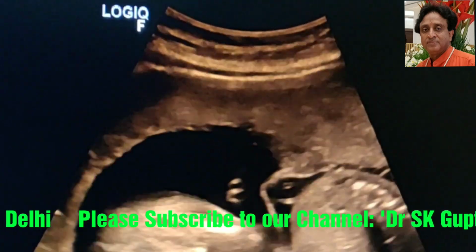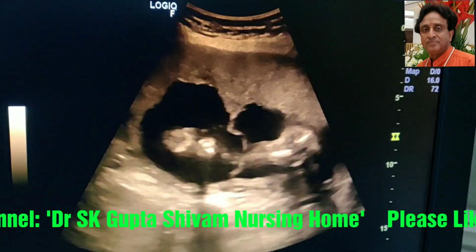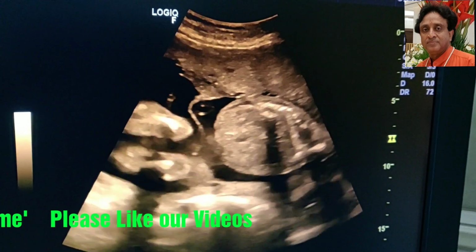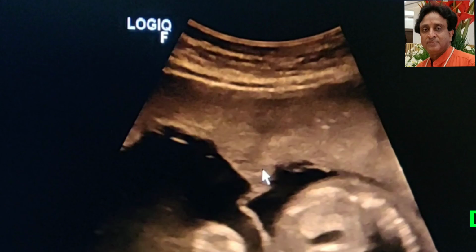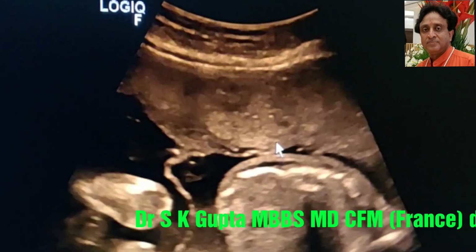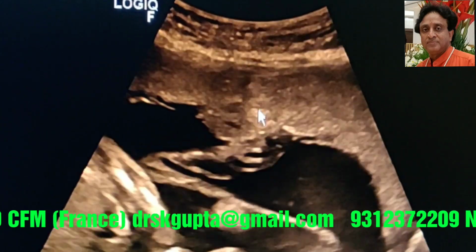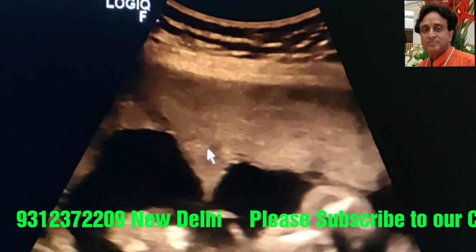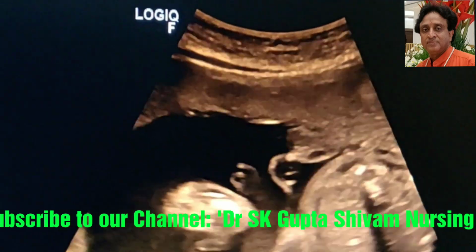Let us try to see whether they are monochorionic or dichorionic. As an intertwin membrane is clearly seen, it is undoubtedly a diamniotic pregnancy. But as far as the placenta is concerned, the placenta is seen anteriorly, and at times it gives an impression that there may be a cleavage over here, but we cannot be sure about it. So it is difficult to say whether we are dealing with a monochorionic or dichorionic twin pregnancy.